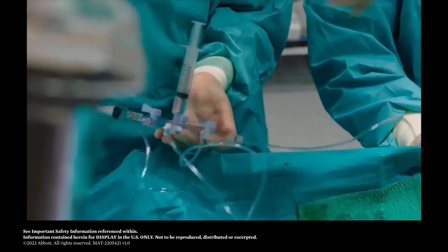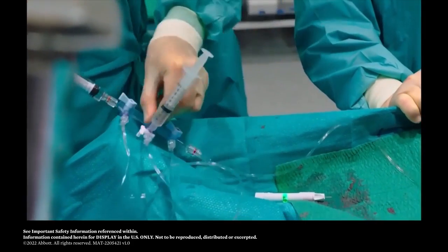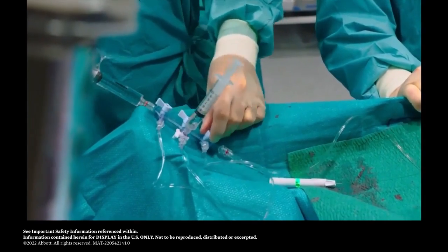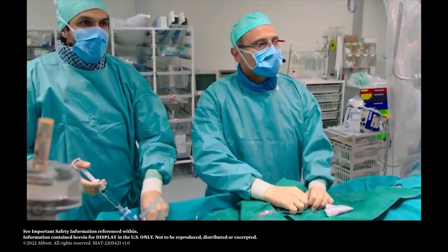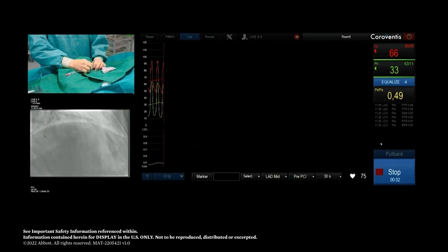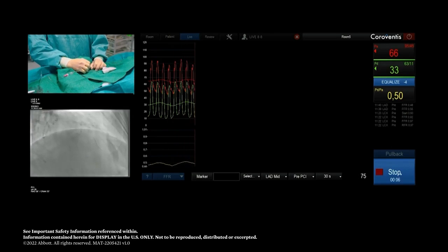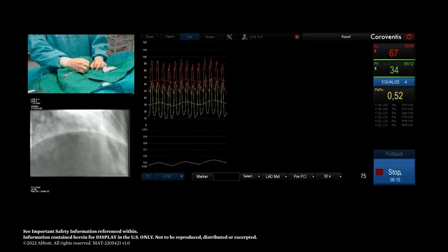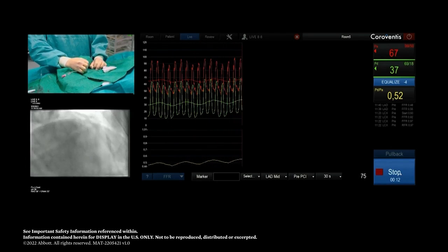Now what I'm going to do is push this with saline, and then the patient will be hyperemic for about 1 minute. And in that time, Dr. Barbato will perform the pullback. Start. Start pullback, please. So we click on the pullback button. Now Emanuele is making sure that the pullback speed is constant and that he has a stable pullback until the tip of the pressure wire.